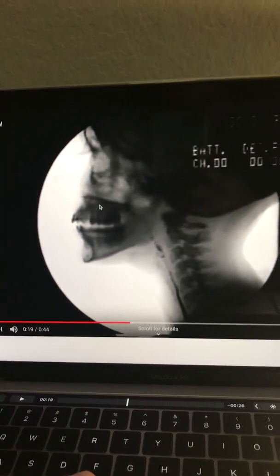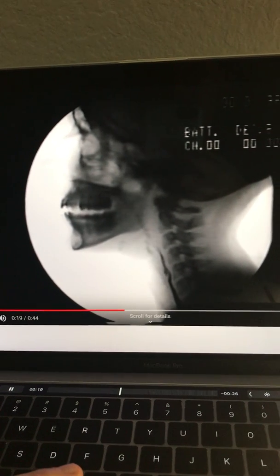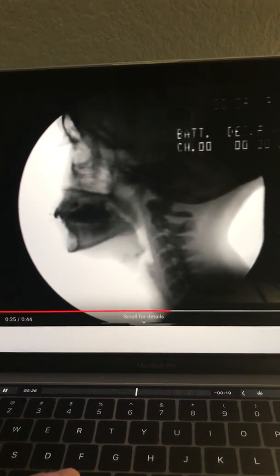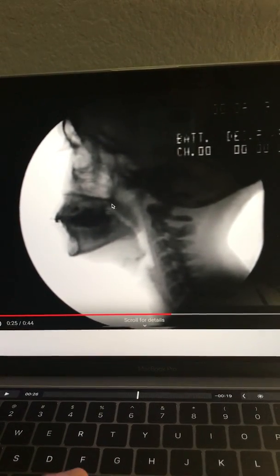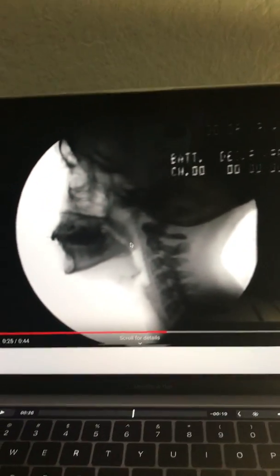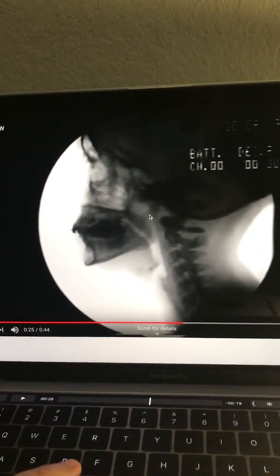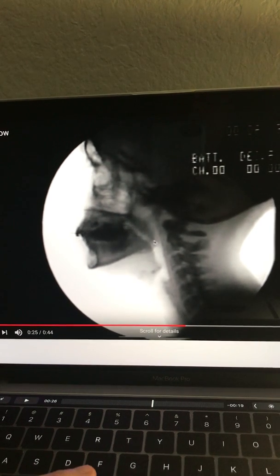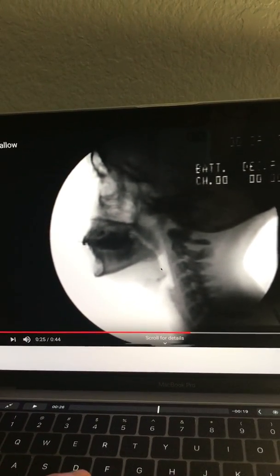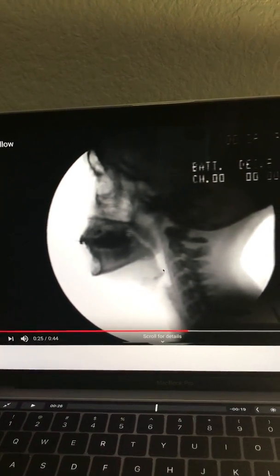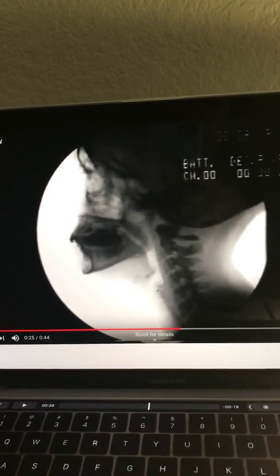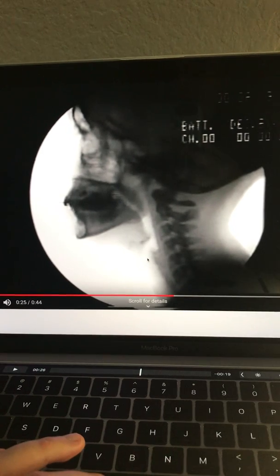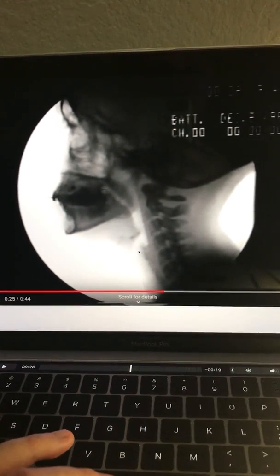This is the hard palate here with the uvula hanging down. The nasopharynx is going to be up here above where the soft palate is, all the way to where the uvula is. Below the uvula is going to be the oropharynx, which extends to where the epiglottis is. Below the epiglottis is where the laryngopharynx is. Right where this white space is, is where the vocal folds are going to be.